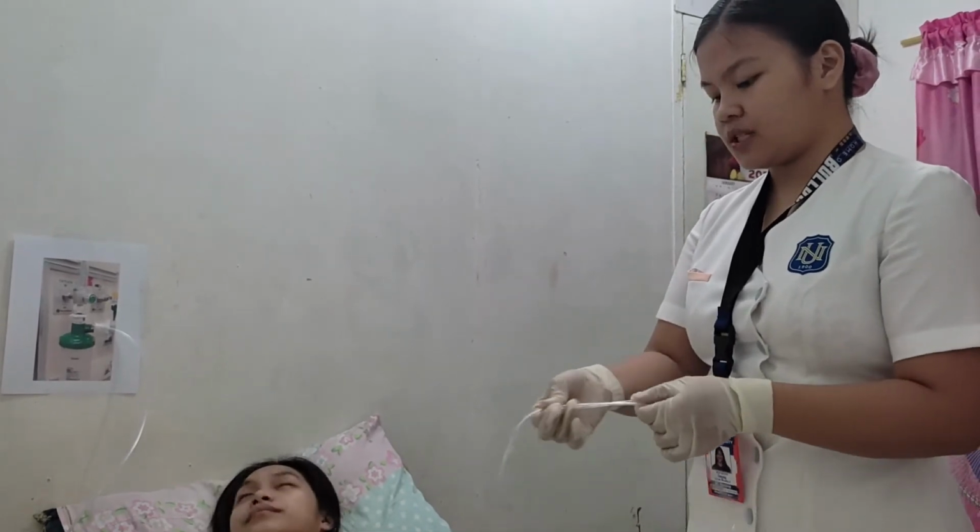Okay, after setting the appropriate flow rate, we will now check for the oxygen from the tube. Now check if the oxygen is moving freely. There should be no kinks and the connection should be alright. This is to ensure that no oxygen will escape.